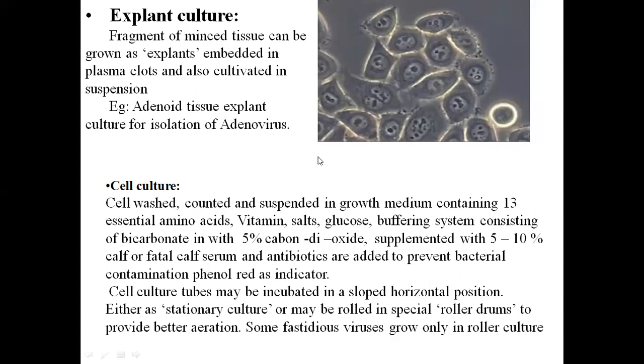See, the cell culture tubes may be incubated in a sloped horizontal position. So this will be maintained as either stationary culture or maybe rolled in special roller drums to provide better aeration. So some fastidious viruses grow only in this type of roller culture.